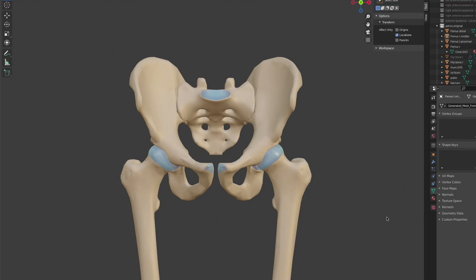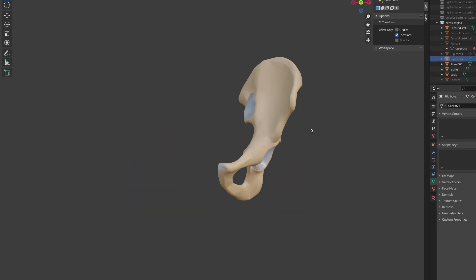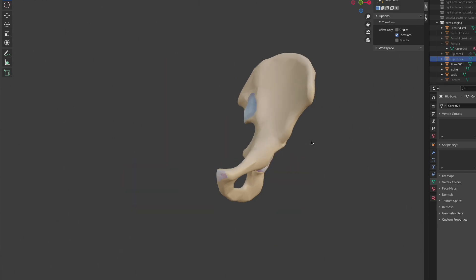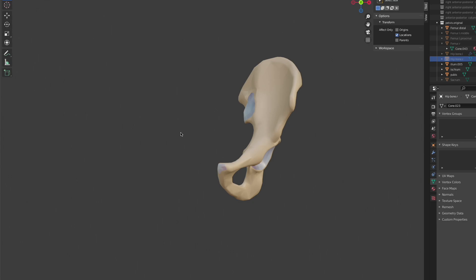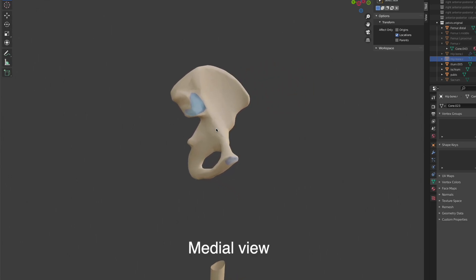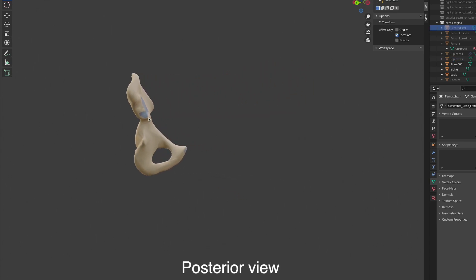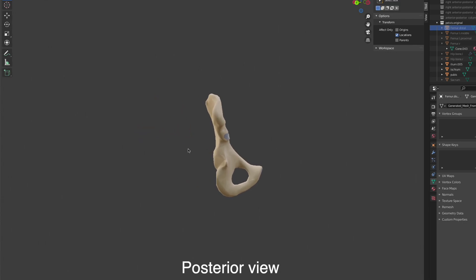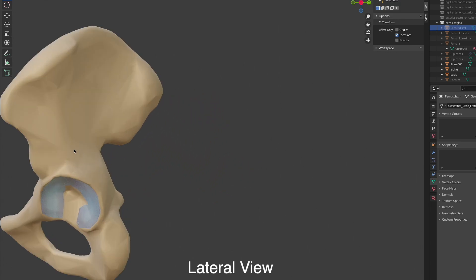We're looking at the pelvis here with both of the pelvic bones on either side, the sacrum at the back, as well as both of the femurs. Let me first isolate the left pelvic bone in order to explain its structure. Here we have the left pelvic bone on its own. This is looking at it from the anterior view, the medial view, the posterior view, and finally the lateral view.